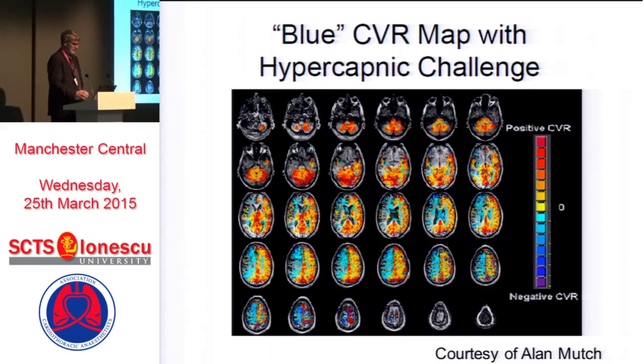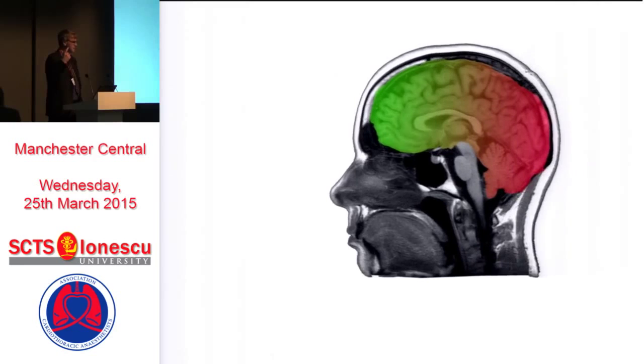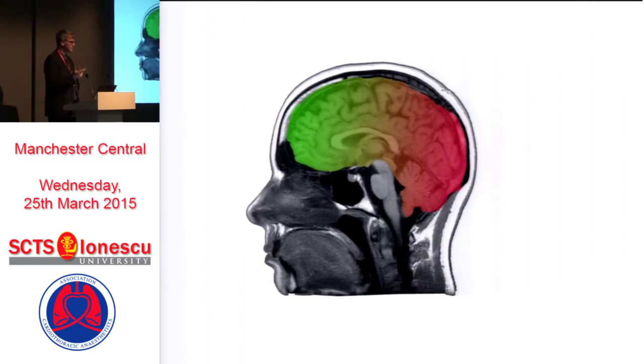It's just the beginning. Because if you look at, for instance, some patients and you use functional magnetic resonance, you have all this heterogeneity in the brain that it's impossible for us to get in real time for the moment. And also when you monitor, for instance, transcranial Doppler and brain oximetry, the signals might be fine and everything might be looking okay, right, but the patient might have a stroke in the posterior circulation, which we're not monitoring at all. So we've seen patients with normal brain saturation who develop stroke postoperatively in areas which were completely not monitored. So again, it's still the beginning and there's still some work to be done.